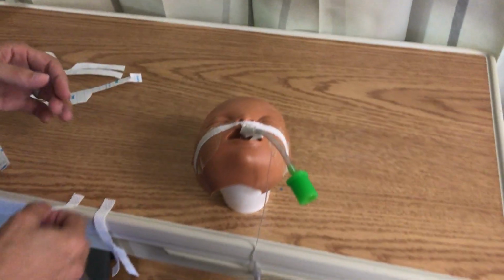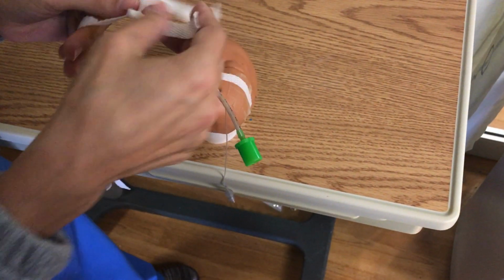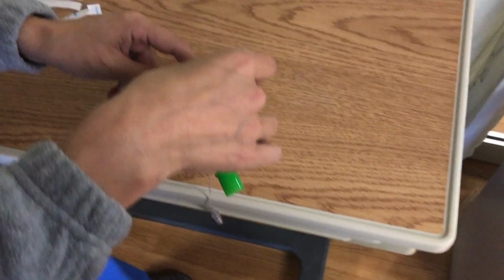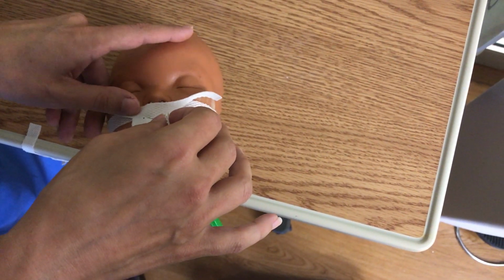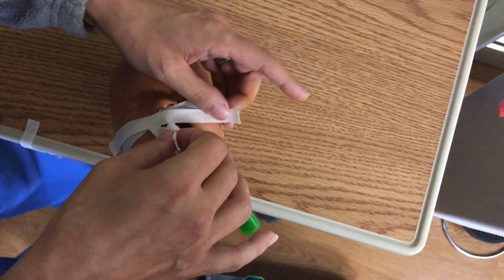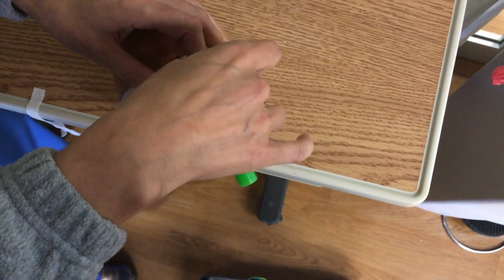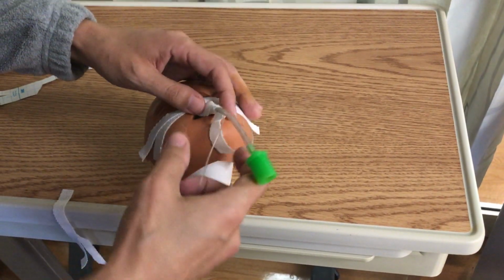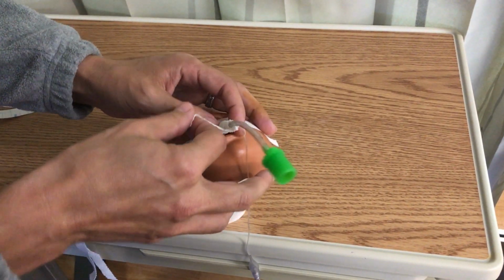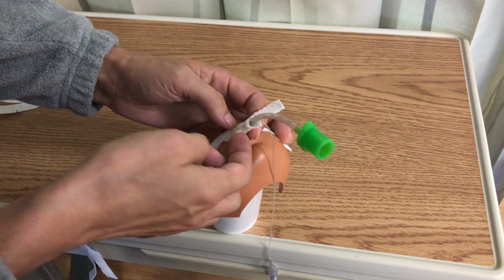So for the next piece, when we put this one on, if our bridge piece and our angle are not right on top of our tube, but instead are over more, so kind of like this, then again what that's going to do is cause a gap between our tube and the adhesive. So now when I try to go around with this piece, that's not really sticking to the tube, and when I go around with my tape, we now have another area where oral secretions and saliva can get underneath and begin to degrade the adhesive.